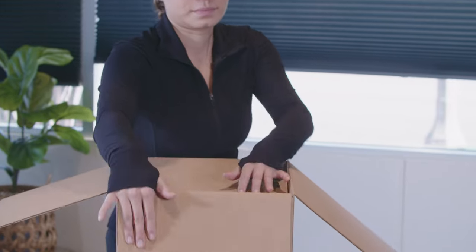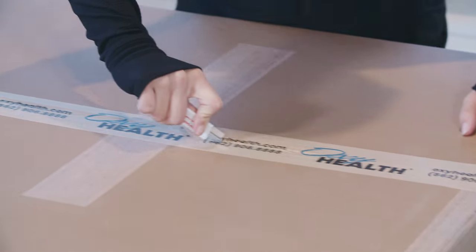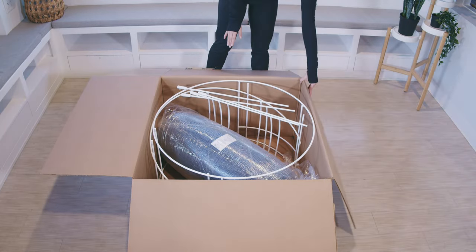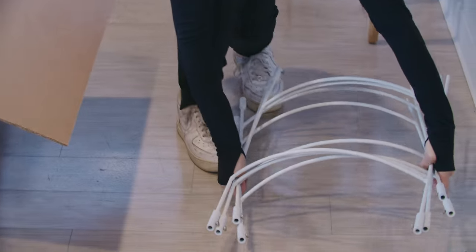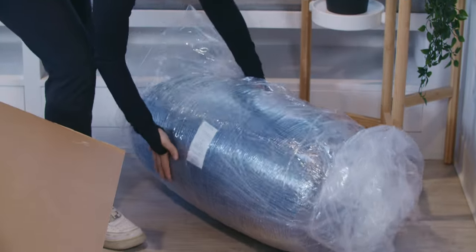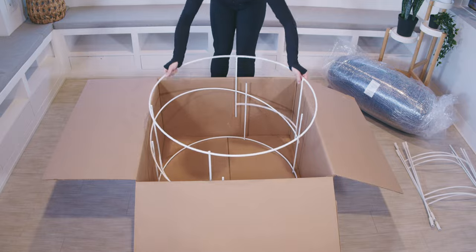First, start by opening up your boxes and identifying the contents. Start by removing the two bolster sets from the box and set them aside for now. Open the box with the rounds, the straights, and the mattress. Carefully remove the modular frame straights and set them aside. Then remove the plastic film mattress and set it aside. Finally, take out the two large head and foot rounds.